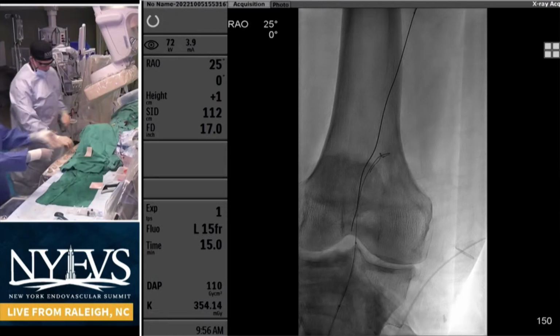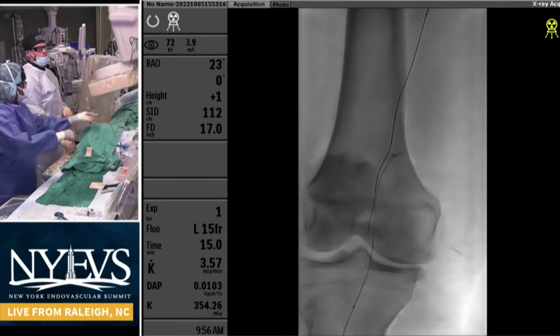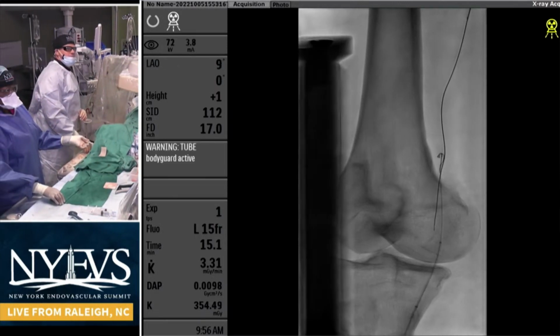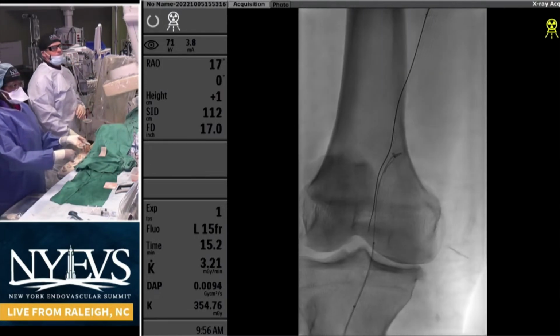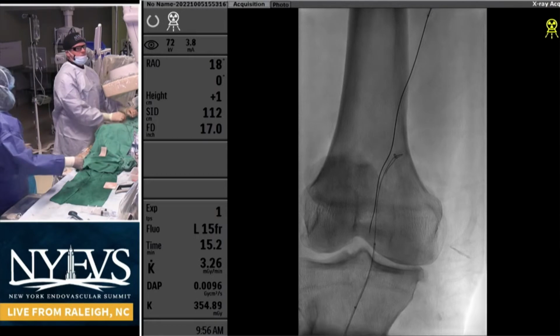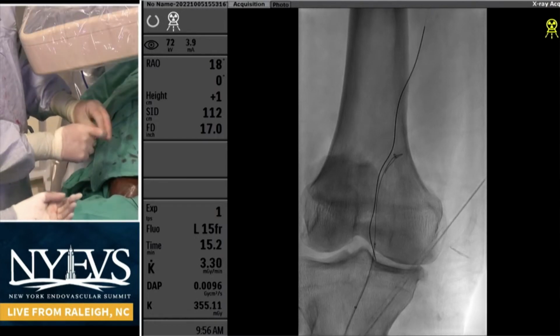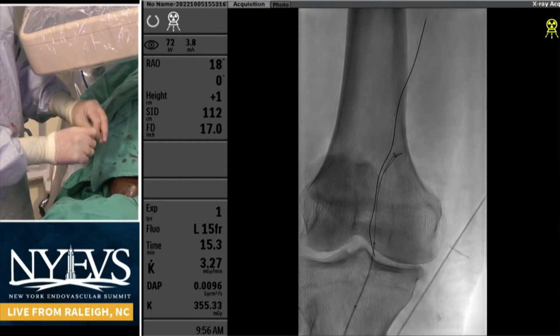I would, just because if I'm lucky, I wouldn't have done that for anterior tibial because you have to blindly take the turn. But if you get lucky, you can go straight into the peroneal from above and cross all this lesion. Has happened to me. There are times I have prepped the leg for safari and then somehow I'm into the peroneal artery. Yeah, I think this is obviously a very tough case, George.